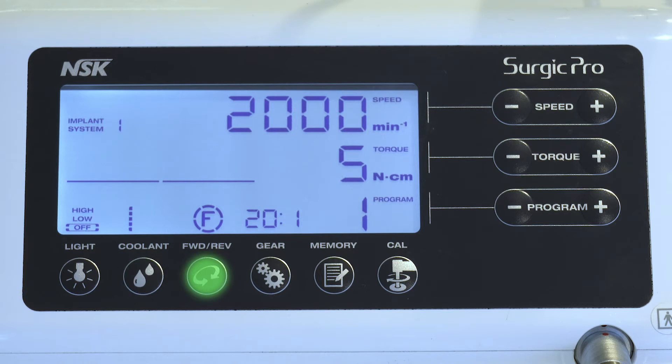Press the forward or reverse key to select the direction of rotation. Press the gear key to select the correct gear ratio of the handpiece you use. Press the speed key to set the required max operating speed by pressing plus or minus. Press the torque key to select the upper limit of the torque range.